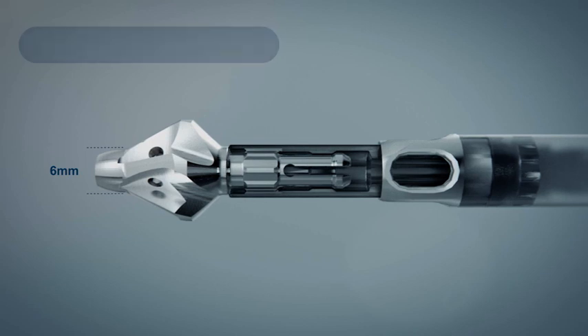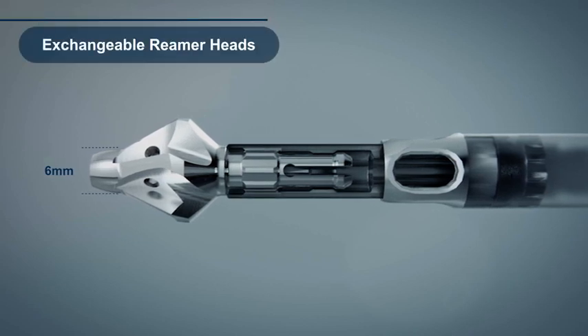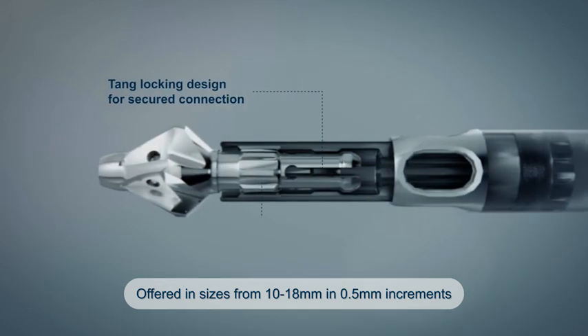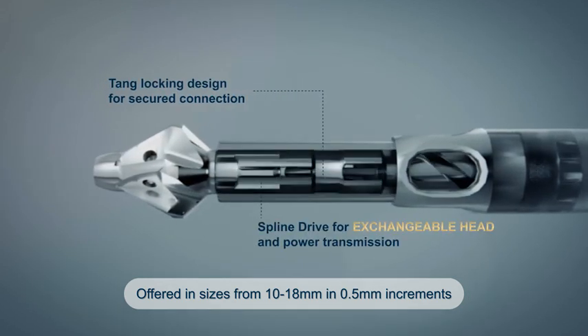The RIA2 has exchangeable reamer heads ranging from 10 to 18 mm in 0.5 mm increments for smaller canal reaming and improved setup efficiency.